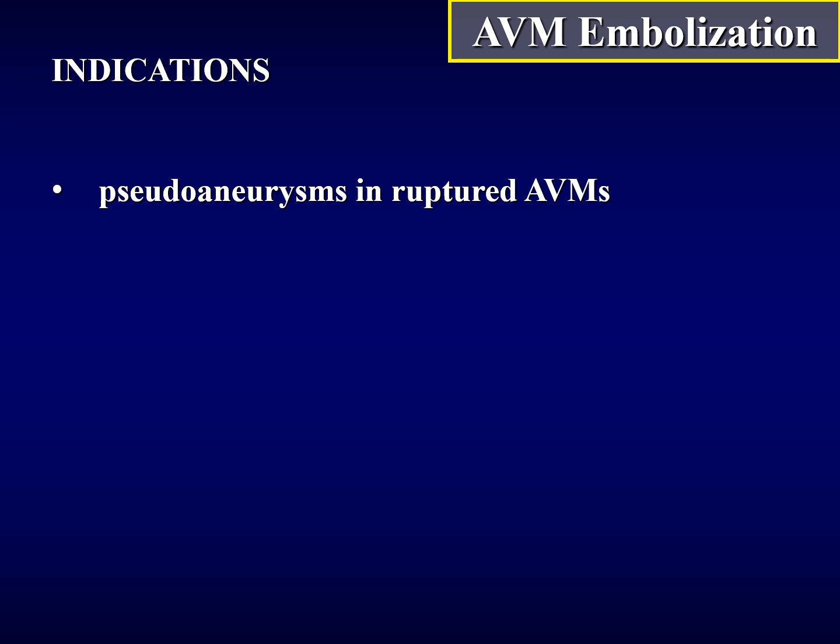So the indications for us for endovascular approach to AVMs start with the pseudoaneurysms in ruptured AVMs.